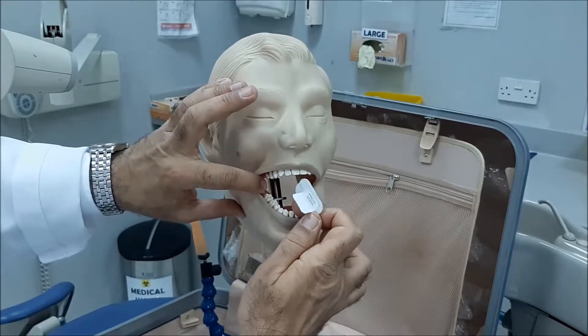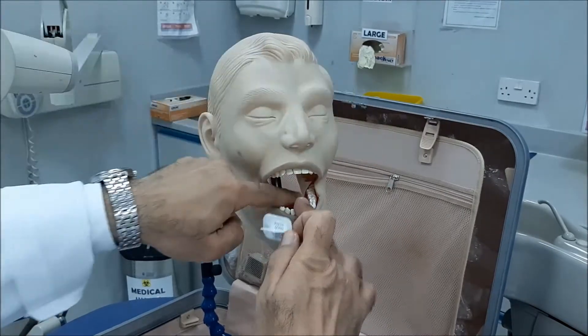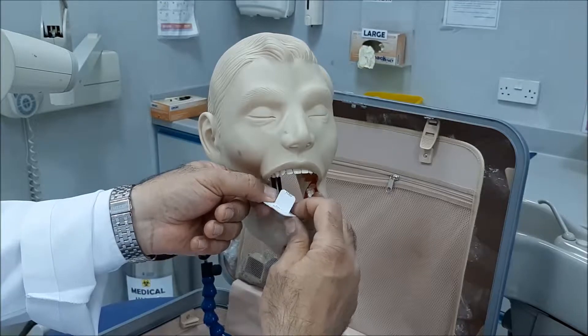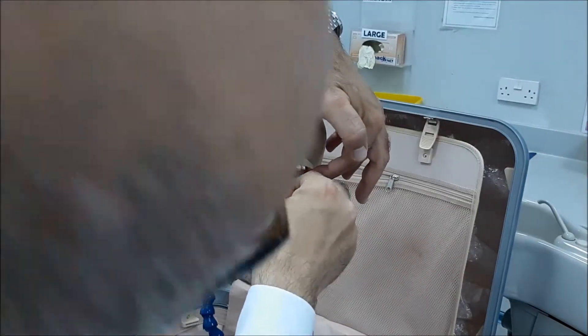You ask your patient to open wide, and then you introduce the film — let me do it on this side. This is the second molar over there. I will look inside, try to locate it, and then introduce it inside the oral cavity. Once you reach the second molar, put it all the way back so that the second molar is biting.